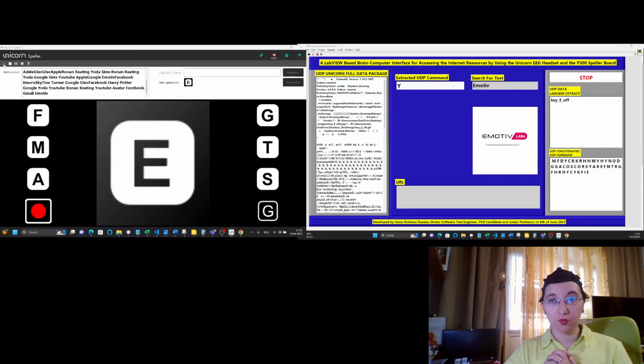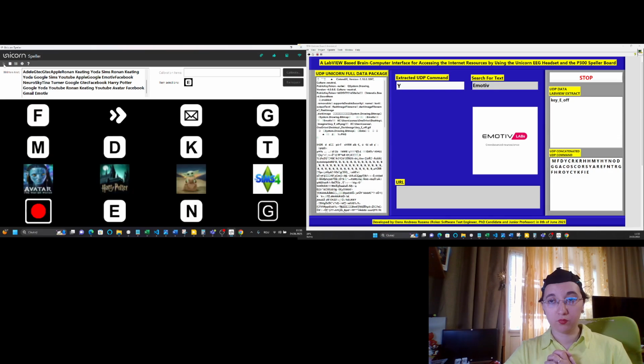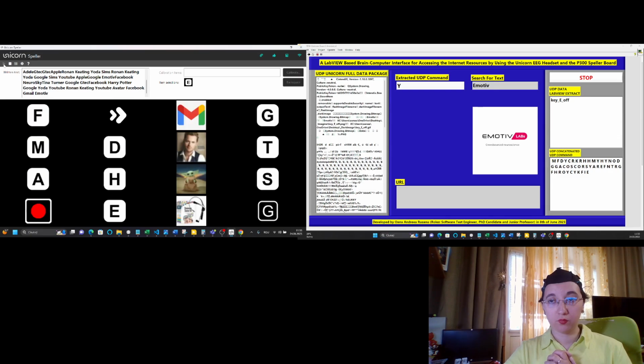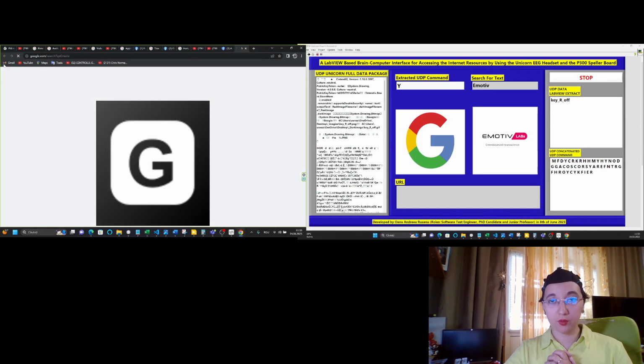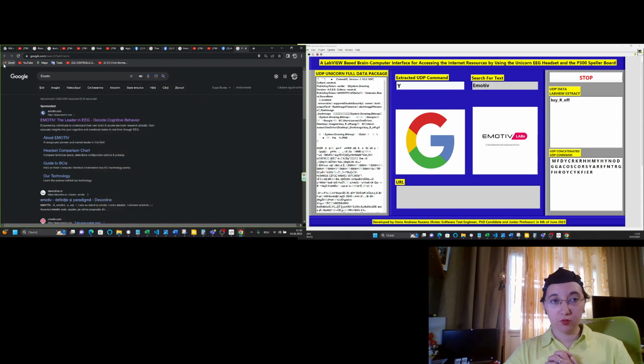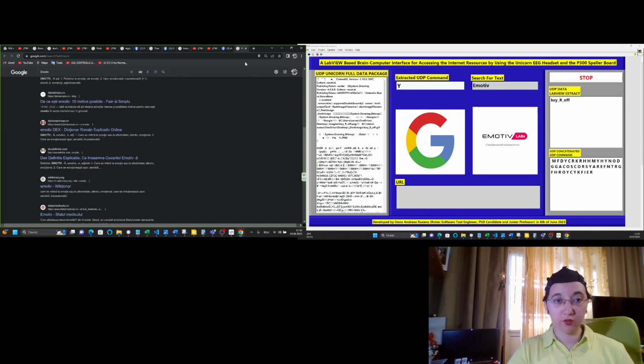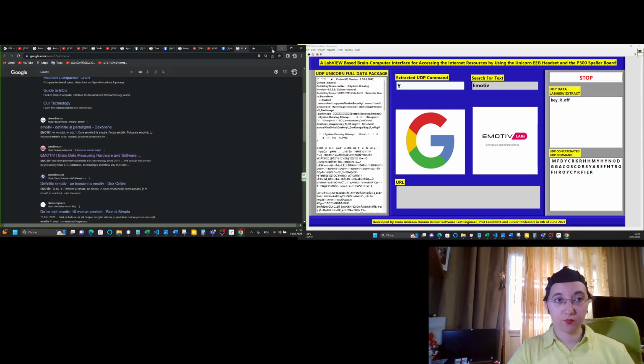That's great. E was correctly selected. Now Google. Perfect. So now Google browser is opening, and Emotiv is the searched option, and here we see the related content.